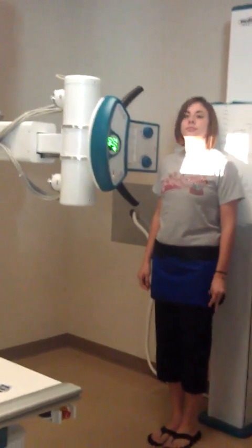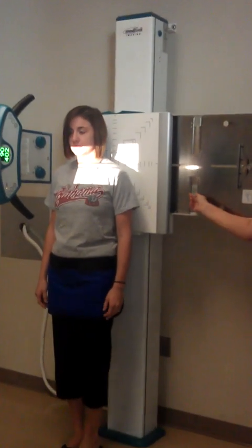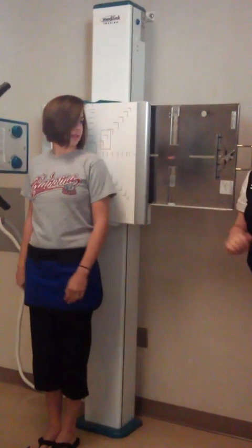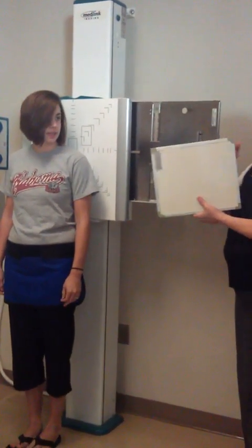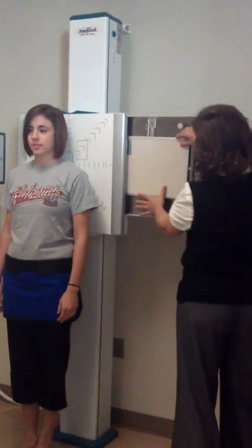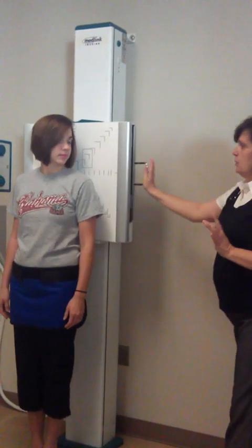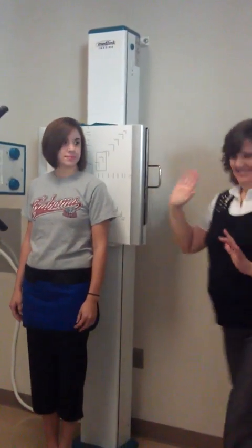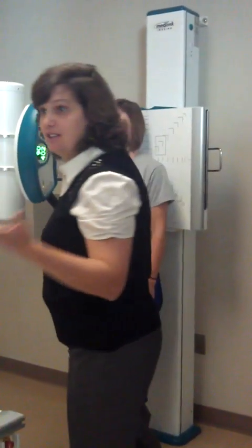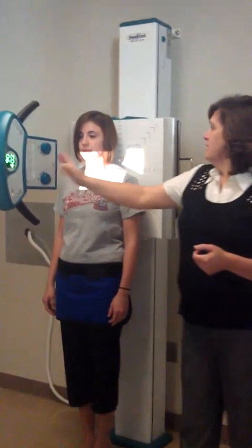We're going to start with her. This is where this little knob comes into play. It is on 10 now because my cassette's going crosswise, so it has to be on 10. We lock it in, push it all the way in. If we don't push it all the way in, we clip something because our cassette's not centered. So we're going to start with her left clavicle.